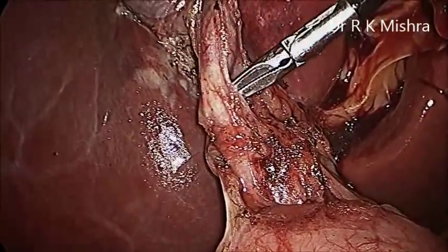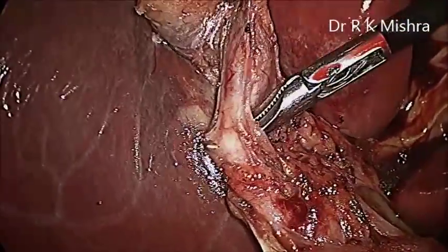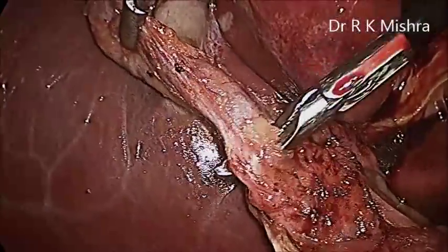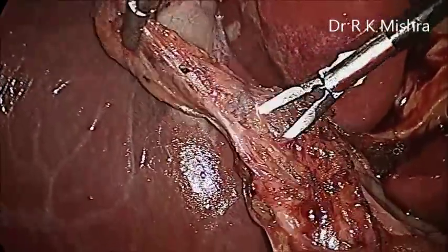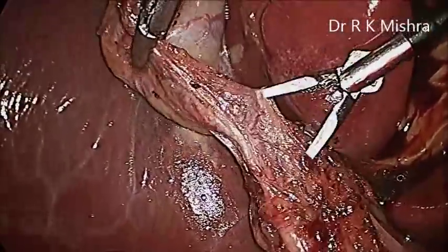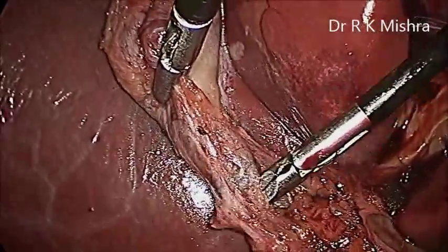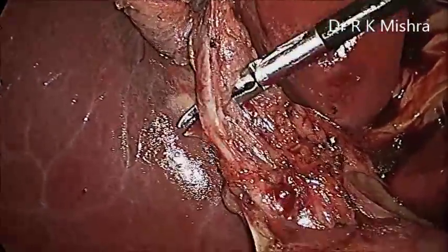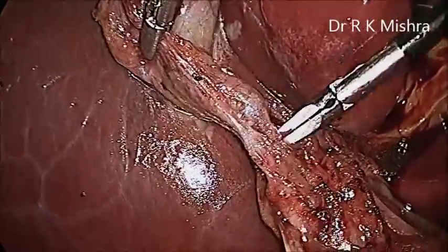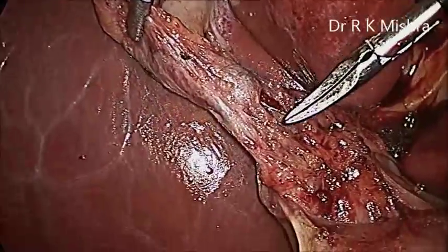And just you can define here slowly by opening the jaw, you can make a window. We also have to make sure that it is properly skeletonized. Completely open, the jaw of the Maryland is approximately 2.2 centimeters in the medium jaw size of the Maryland. And here this is open.